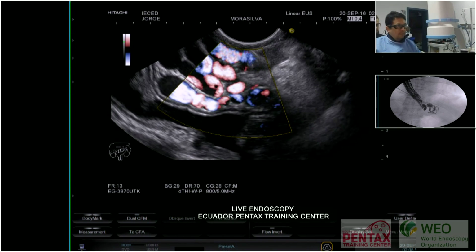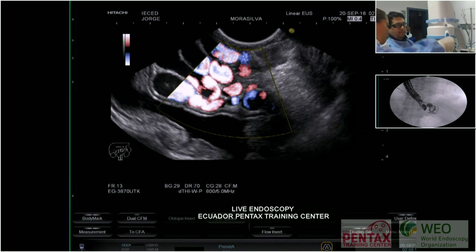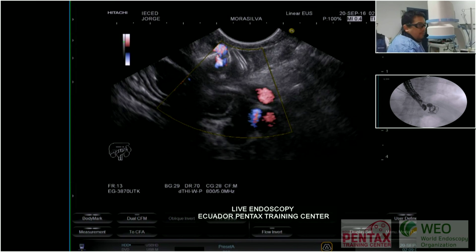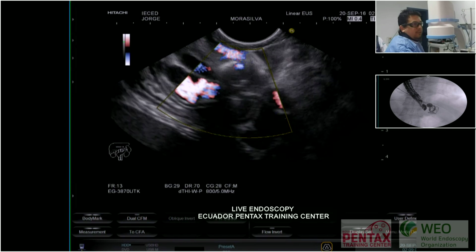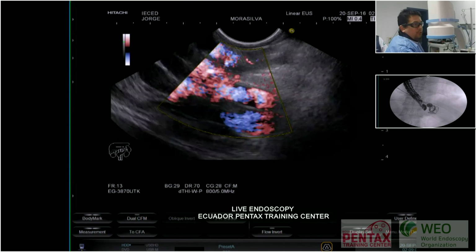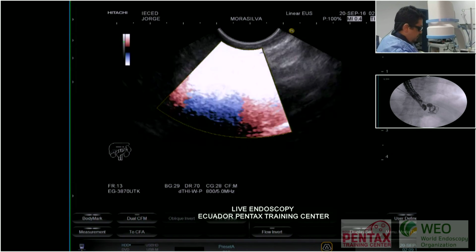You see here, less flux inside the vessel. That's good. And here, the feeding vessel totally occluded, okay? I will show you now the endoscopic aspect with the gastroscope, okay?